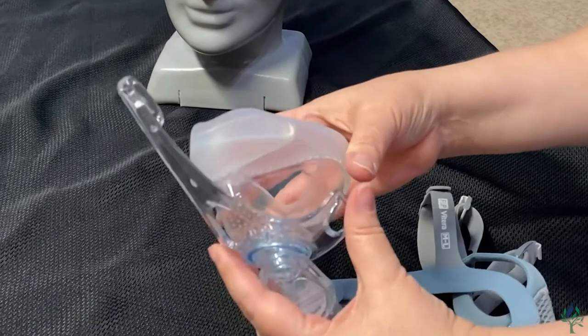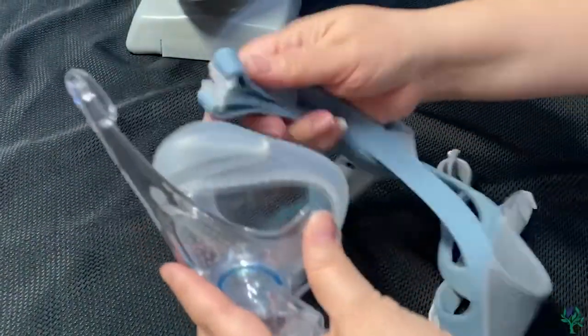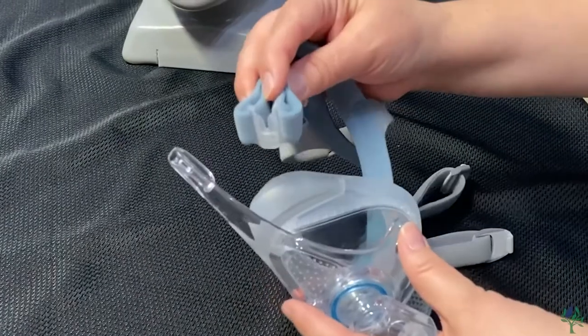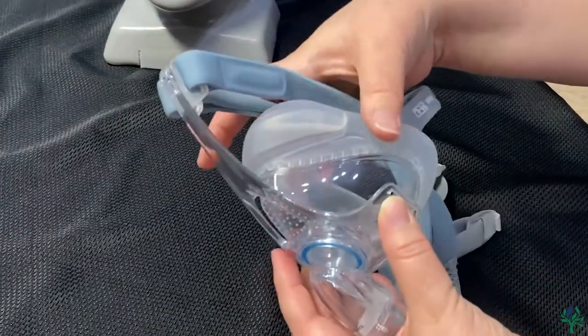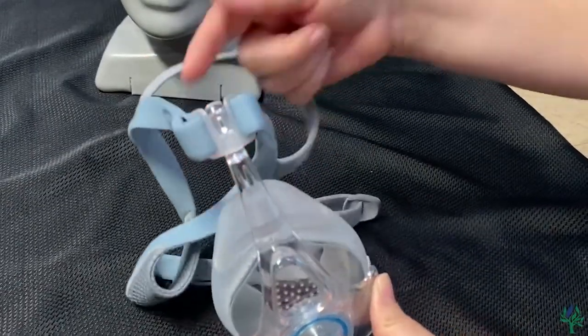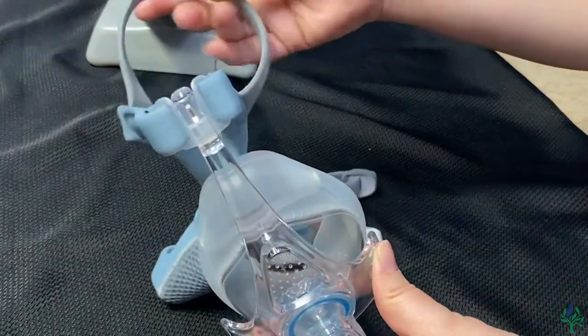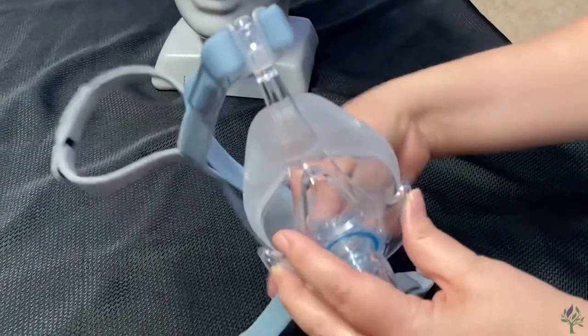To reinsert it, just snap it right back into place, then grab the headgear — there's only one way that it will go on. Slide that in there and as it snaps into place, your headgear will be complete. Feel free to wipe this piece down here, hand wash it, and then just lay it out to dry.